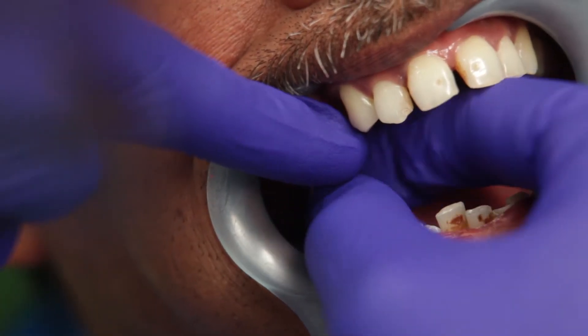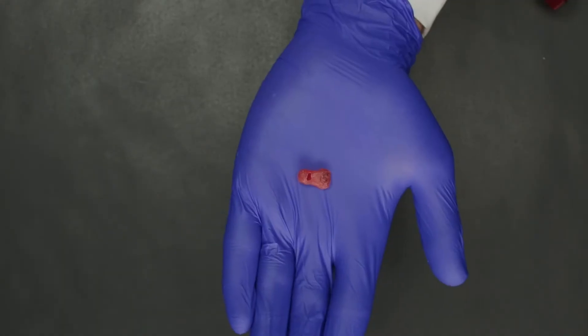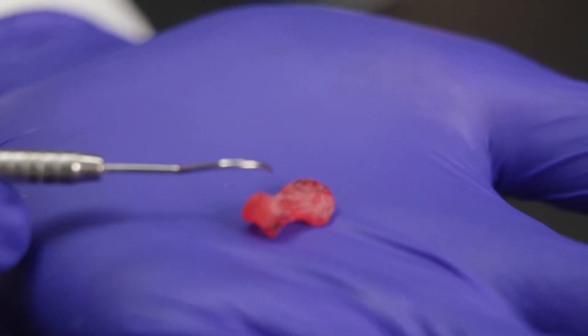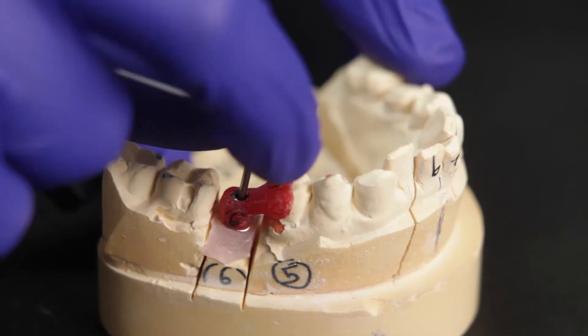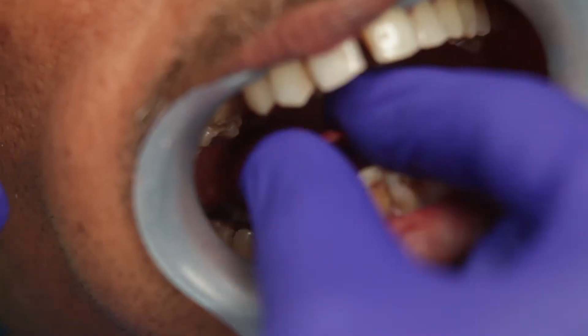The first step is obviously to remove the healing abutment from the implant. The lab has also sent me this transfer jig so that it is easier for me to try-in the abutment onto the implant. I have placed the transfer jig onto the abutment on the model. I am now opening the abutment screw so that I can pick up the smart abutment and carry it to the patient's mouth.